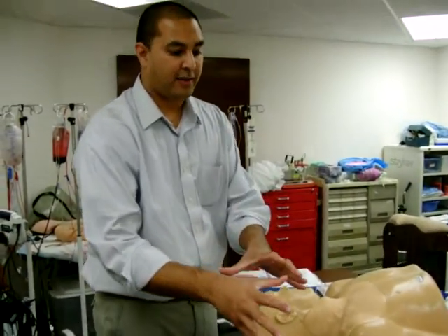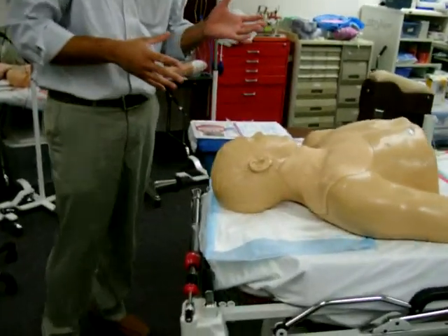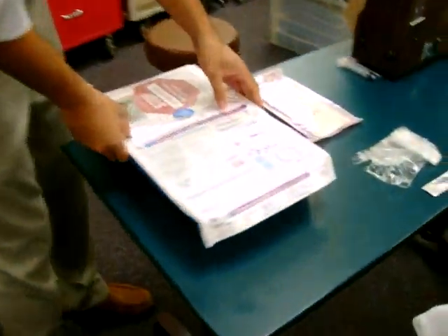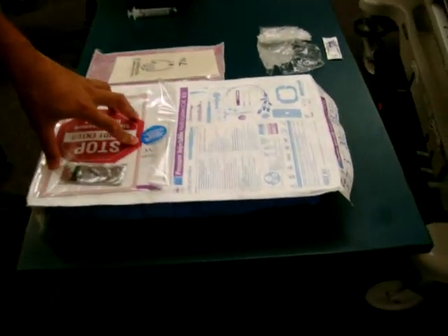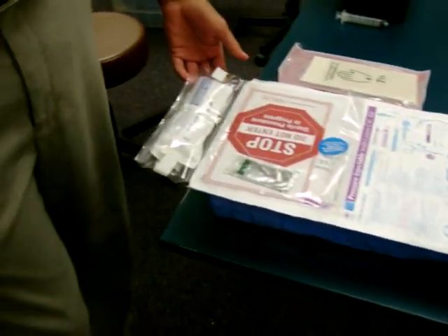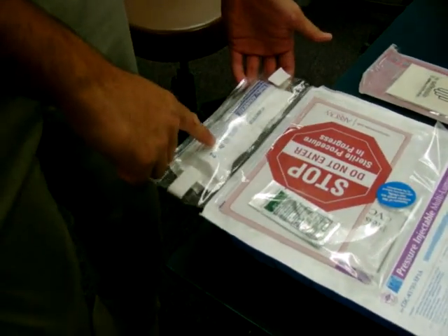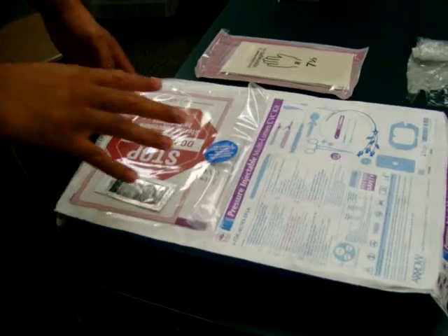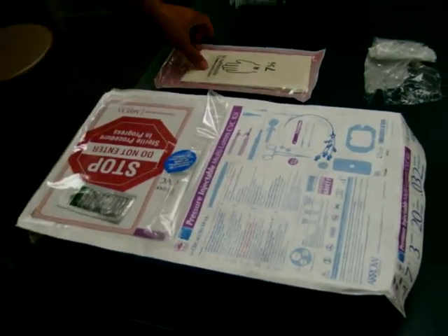Positioning is right, ultrasound is set up, now we'll go over sterile technique. Here we have a couple of things — it depends on what kind of kit you're going to use. This happens to be an all-inclusive kit which includes some sterile flushes, the drape, cap, gown, mask, everything that you would need to do the procedure except your gloves.